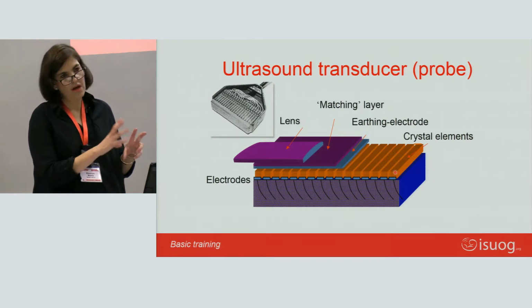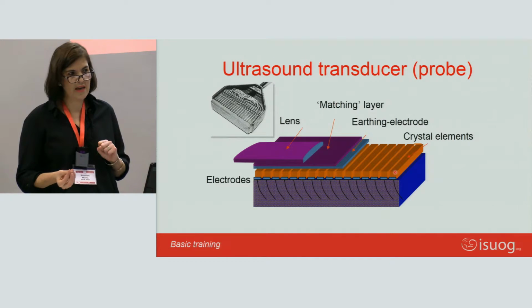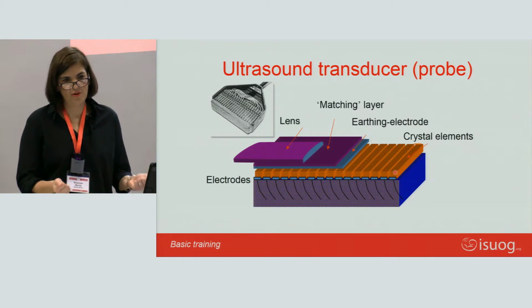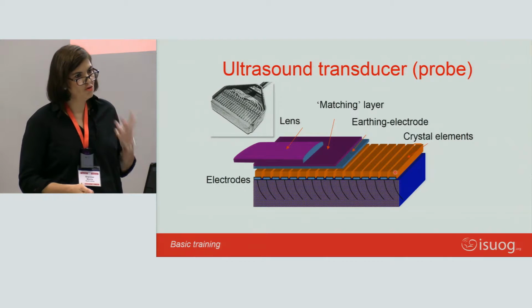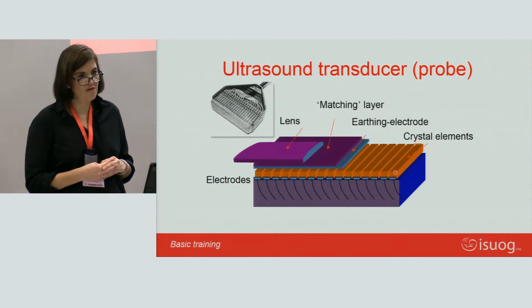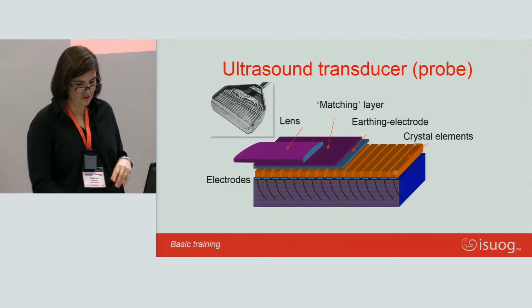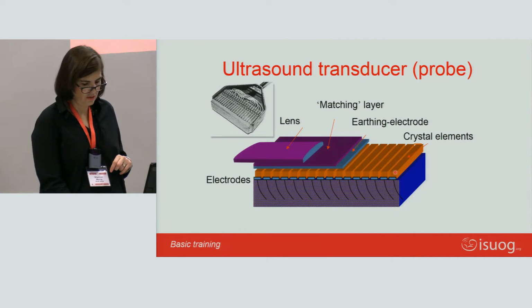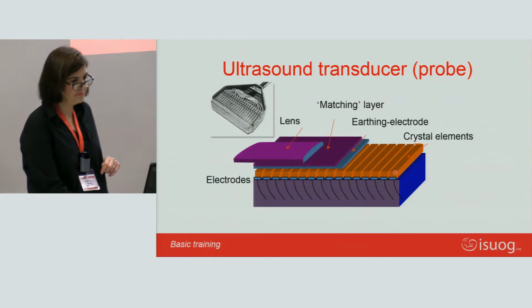Underneath the ultrasound machine, there are places to put the cable. If you let that cable lie on the floor and you ride over that cable with your ultrasound machine wheels, you will damage the probe. And if you drop the probe, you will also damage those crystals. And they are very expensive things to replace. So you have to look after your probe because it's very important. If you don't have that, you'll see nothing.